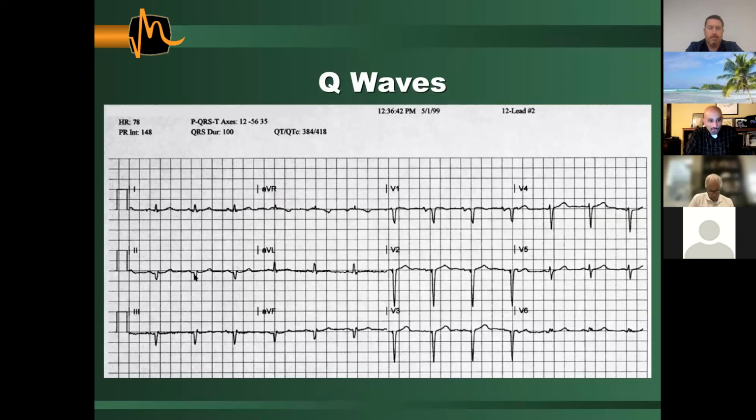So here's a patient with an old MI. He's had an old inferior wall MI, probably anterior wall MI. There's Q waves here. There's no deflection before. You don't know when it happened. The rest of it looks back to normal. So this is just a remote MI.